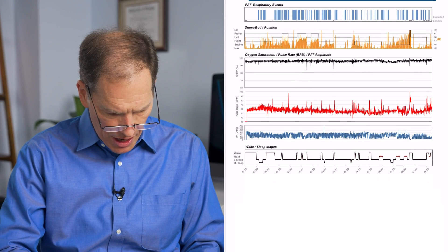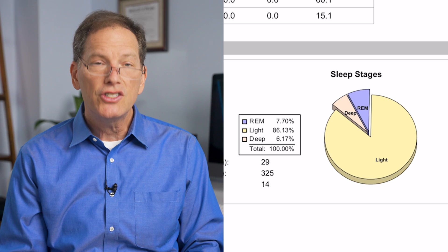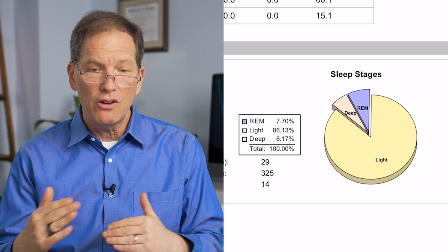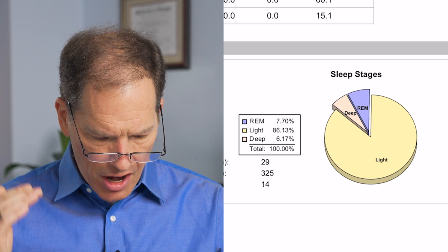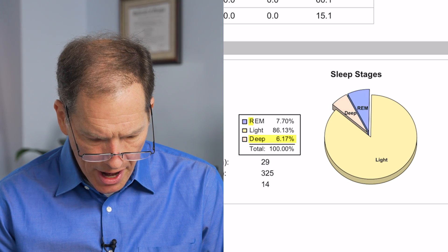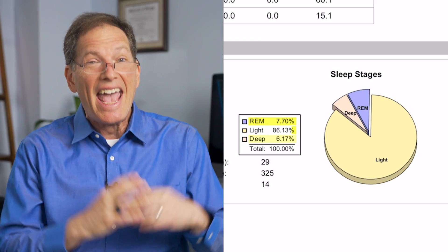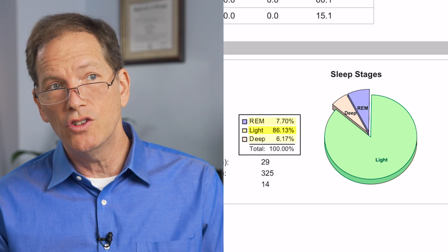In this case, we might think about using something called a CPAP machine, but we also might consider a positioner — something that forces people to sleep on their side. A few more things to think about while looking through this data are the sleep stages. While sleeping with this many respiratory events, this individual had a very small amount of deep sleep — only 6%, when normally we'd see about 25% — and REM sleep of only 7%, again when normally we'd see about 25%. We're seeing 86% light sleep, which is way too much, and is another indicator that this person could be having a respiratory disturbance or something like sleep apnea.